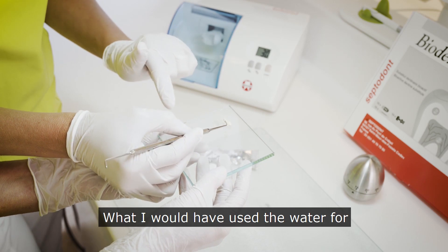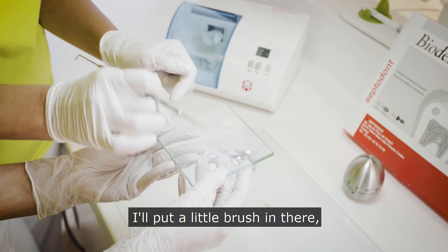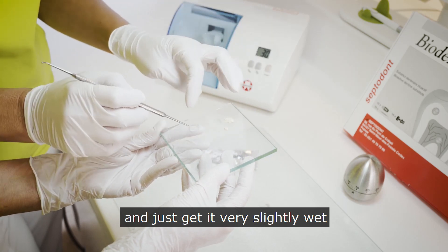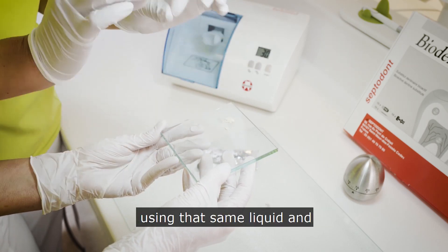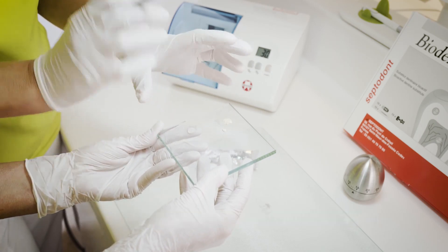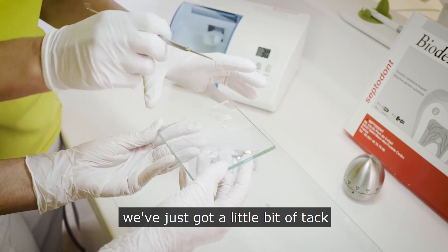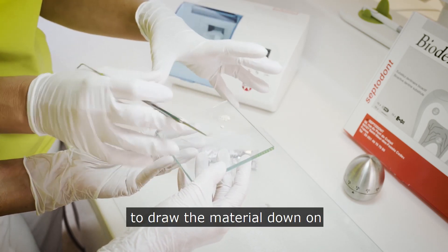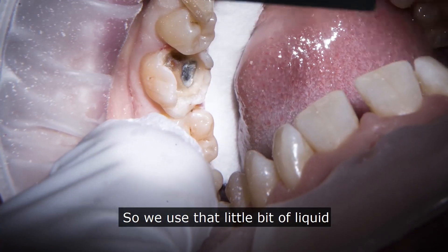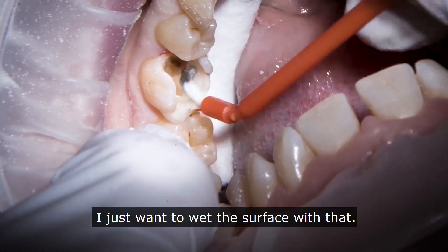What I'll have used the water for — and you'll see me using it shortly — is using a little brush to go over the cavity and get it very slightly wet using that same liquid from the biodentine capsule. I don't want it pooling, just very slightly wet, so when I carry the material to it we've got a little bit of tack to draw the material down into the cavity in the position that I want it.